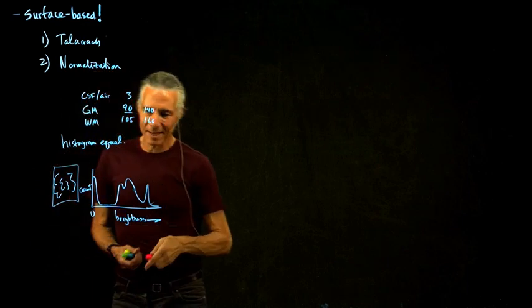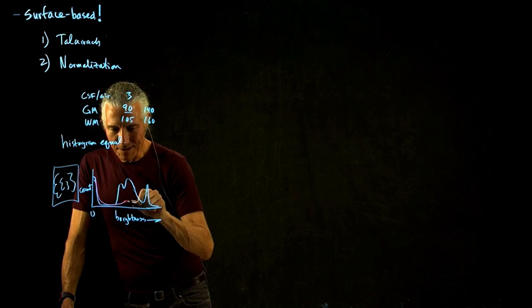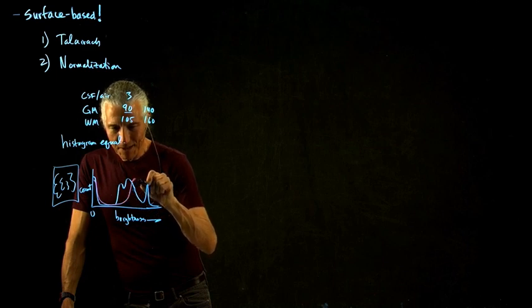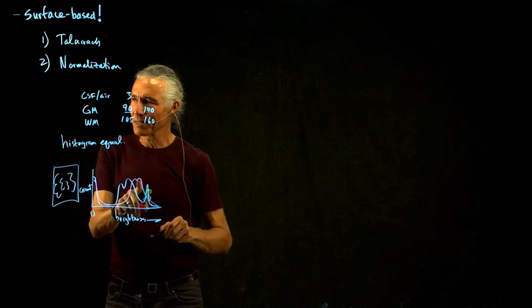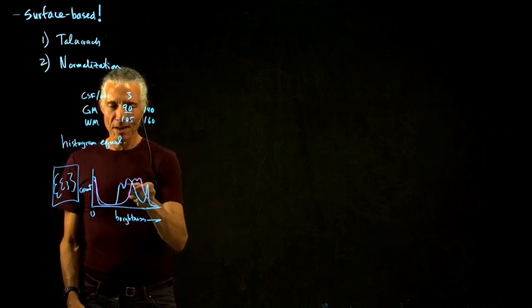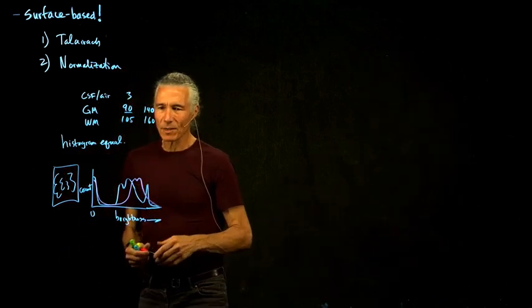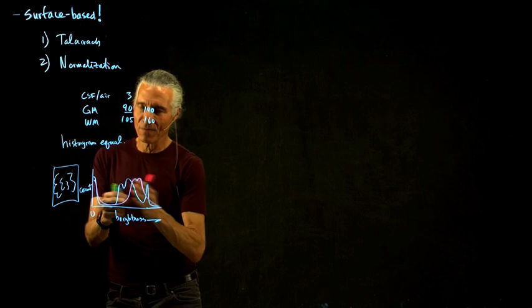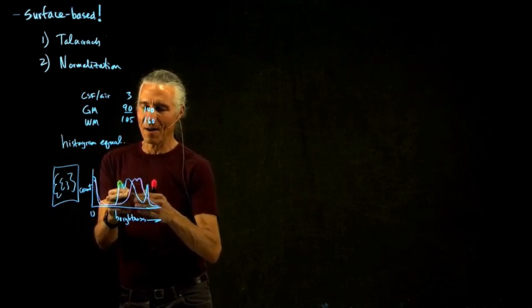But the problem is, there's going to be some that look like this, where the slice was a lot brighter. There's going to be some that don't have this obvious difference between them. So the way histogram equalization works is you look at the histogram and try to figure out where the white matter is based on how many pixels there are.